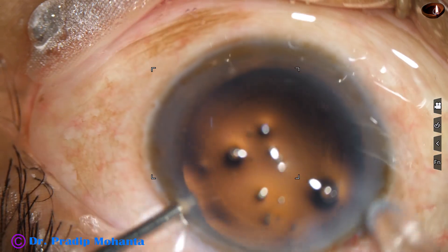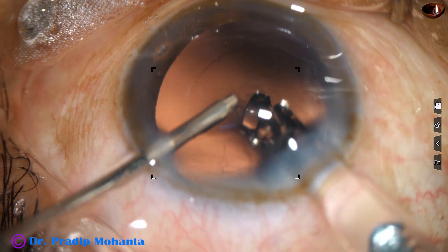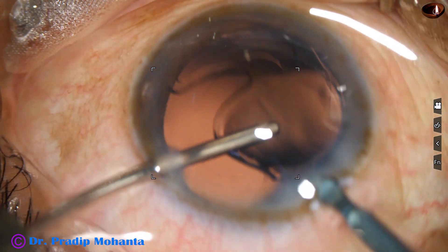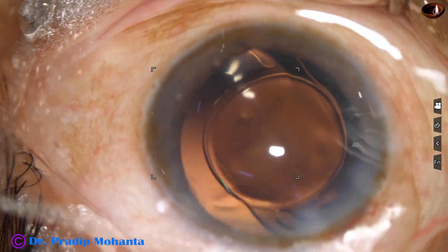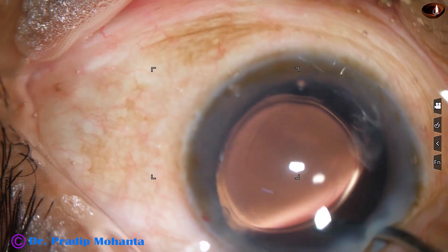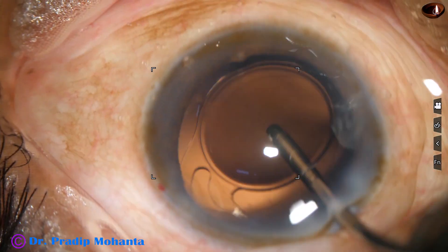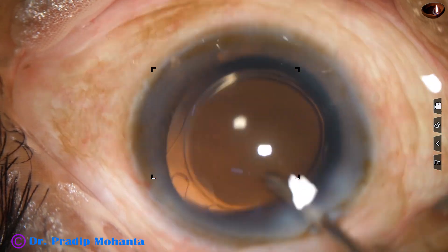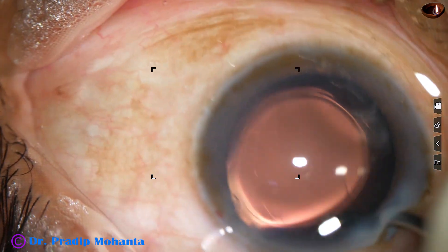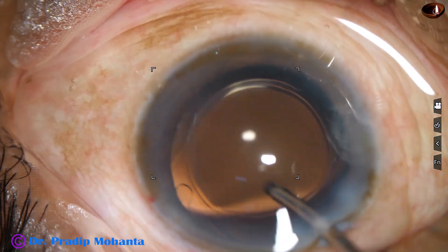A single-piece monofocal intraocular lens is being implanted in the capsular bag. The anterior chamber is maintained by irrigation, and this is known as hydro-implantation of the intraocular lens. A dialer — meaning a Sinskey hook — is not required most of the time; you can manage with the irrigating cannula itself.